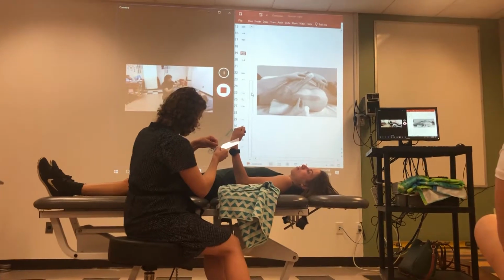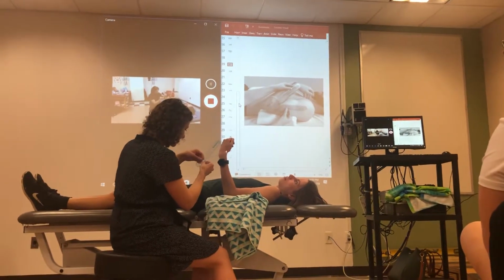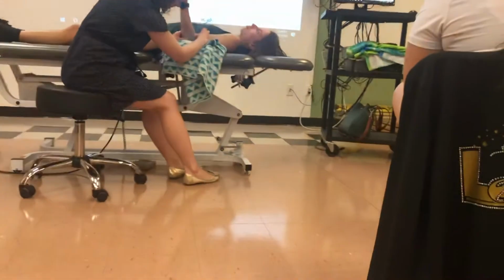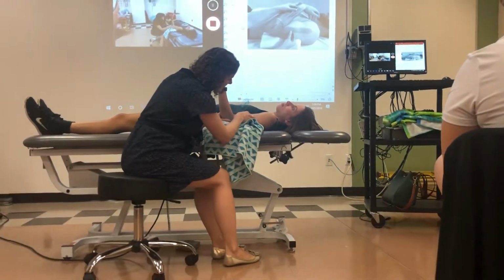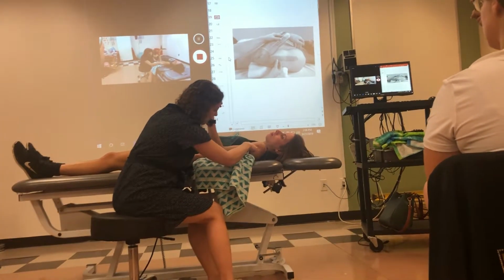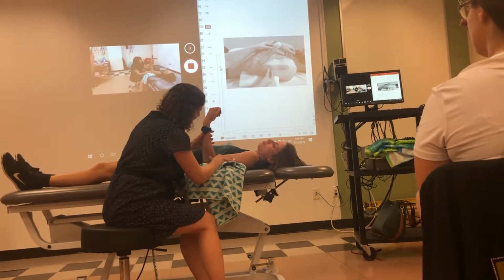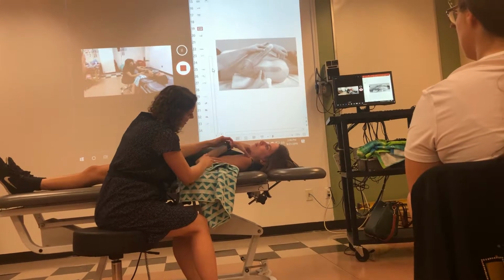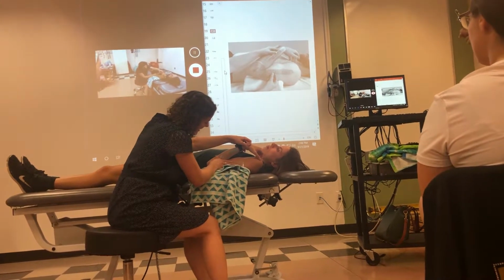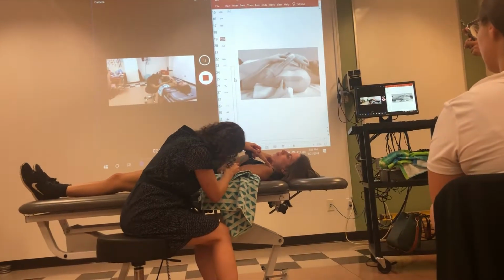And I'm using a small one, but you can use your big ones for this. That's fine. Okay, so I'm lining up at the lateral epicondyle, midline of the humerus, and you can use the greater tubercle as your end bony landmark, and then bringing her down, keeping that distal arm, or that moving arm, towards that radial styloid process. And I was pretty close, but not quite.